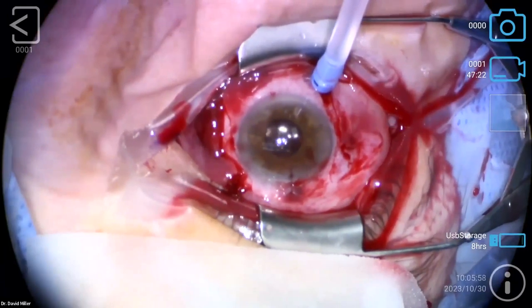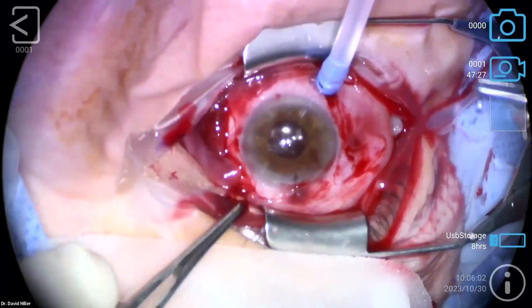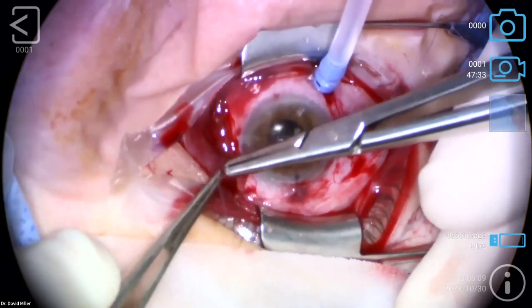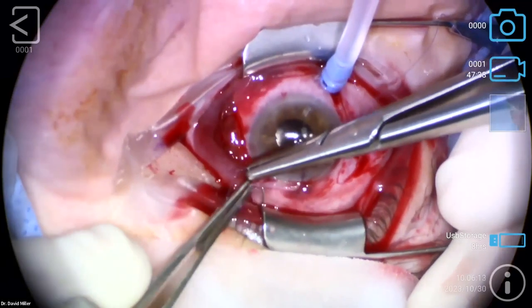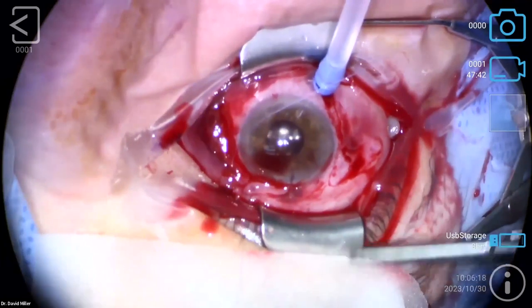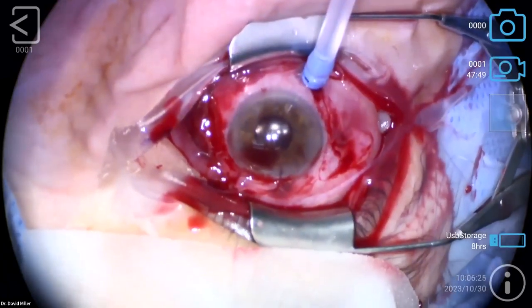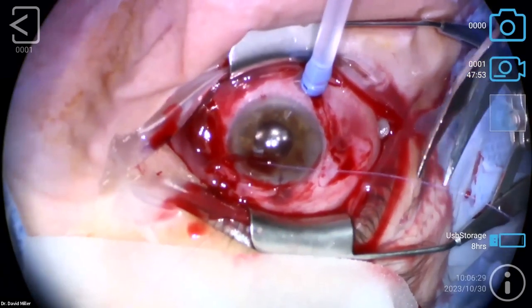Let me show you the... Here, you like that. These are the sutures I care more about, actually. You want to make sure that the conjunctiva is well up over your Gore-Tex. You don't want the Gore-Tex being exposed while it heals, or healing up on top of the conjunctiva, just because that's the infection risk. This is too long. Just cut it right there, way down. Yep.